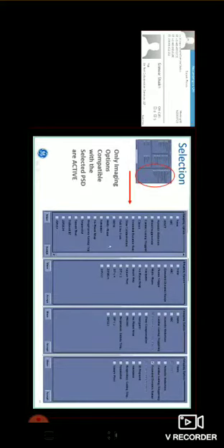In the imaging parameter options, you can see them on the parameter screen, in the lower left corner. In this particular image, all these imaging options are active: FC, flow compensation in the frequency direction; spatial saturation, where A means an anteriorly placed saturation band; no phase wrap is active; EDR and a few others. So here you can see which imaging options are used.